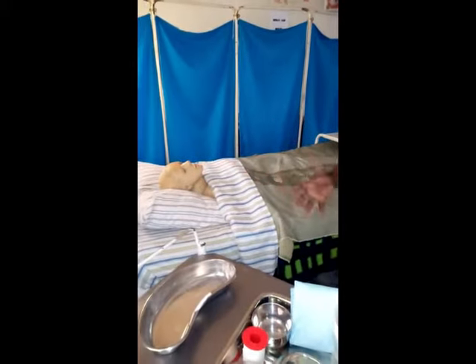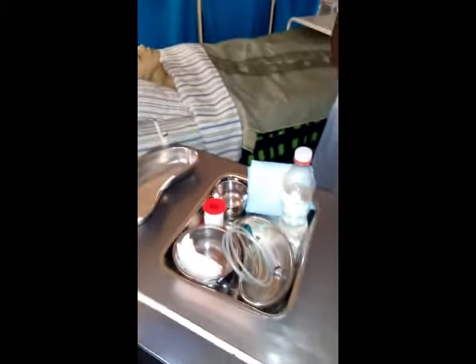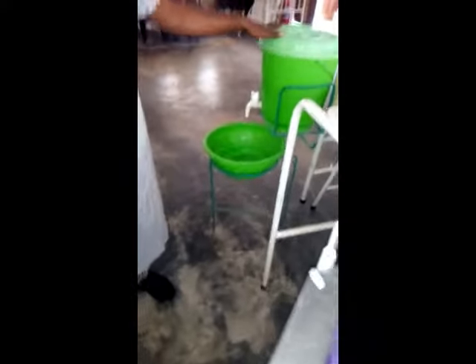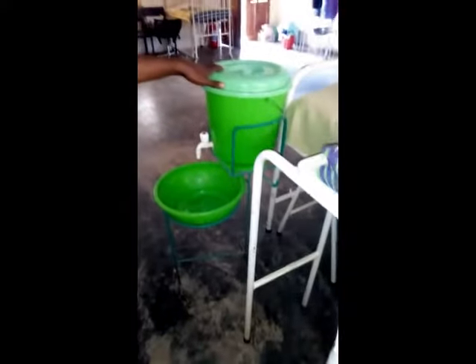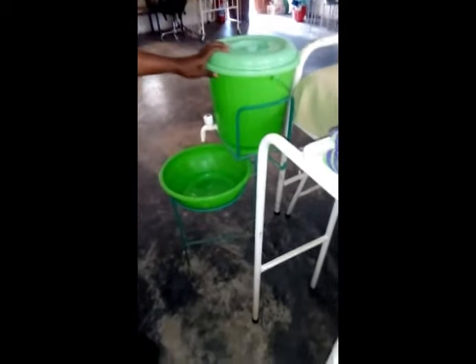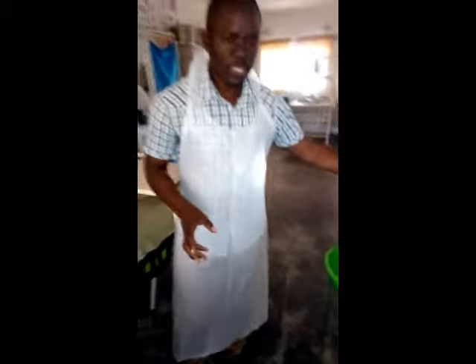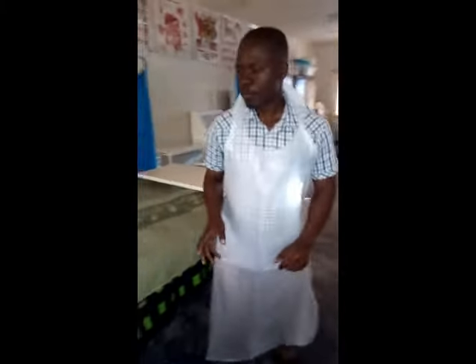Okay. So I've introduced the trolley and all the equipment that I need. Then I have to also say we need the hand washing facility, because this is very, very important. Hand washing is vital. It is infection prevention. To prevent infection in any procedure, the hand washing facility has to be available.